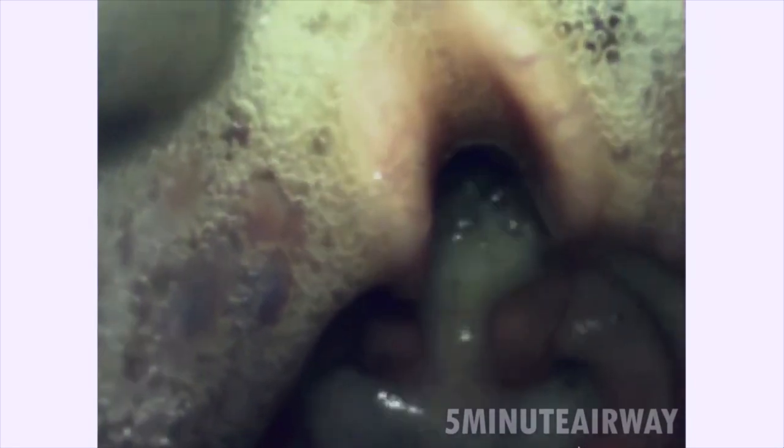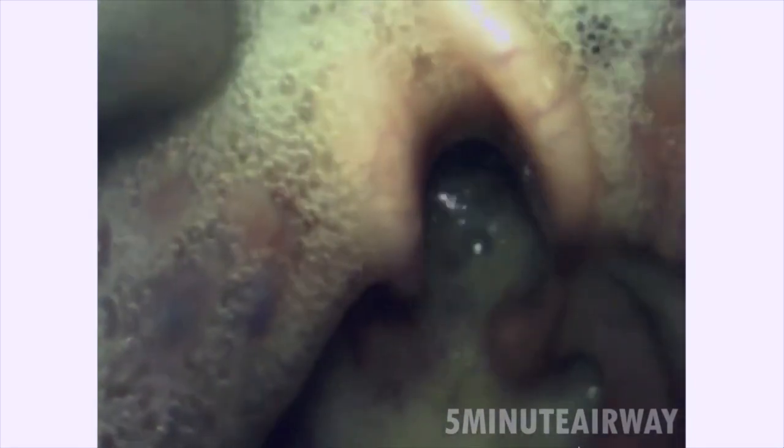And so here we have a little bit better engagement of the vallecula, and we see how that epiglottis pops open, right? We're probably going on a minute now where this patient isn't being ventilated and isn't being oxygenated. So it's probably not the best choice for this patient. And at some point, you make the decision, I think it's time to back out.